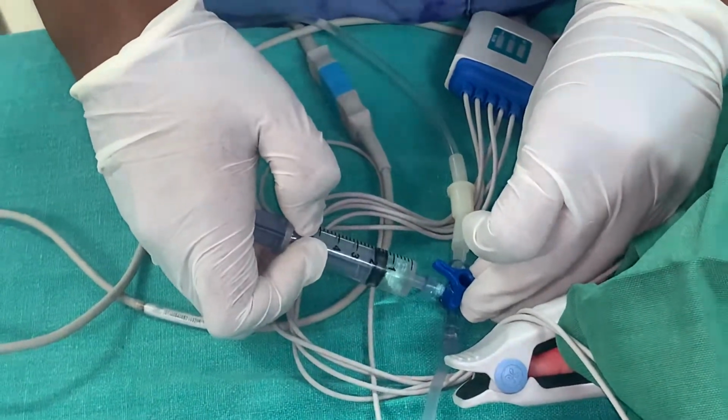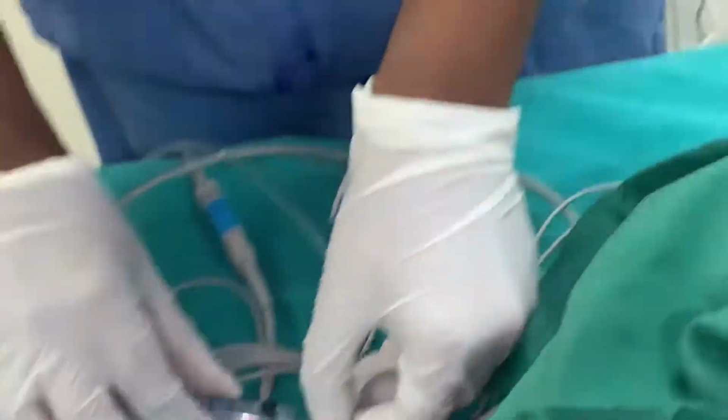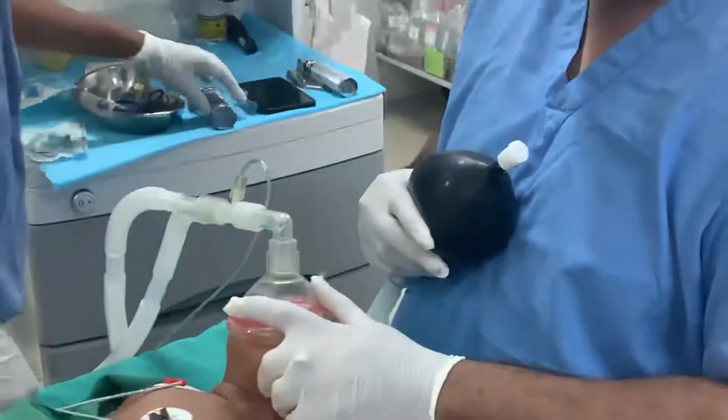You want to tell us what's going on, Nishal? We have induced with sevoflurane. Okay, so that's sevoflurane that's coming in from there. And we have given fentanyl, now we are giving succinylcholine.